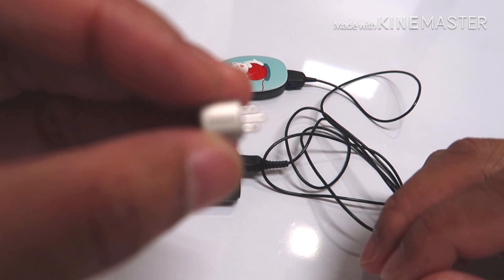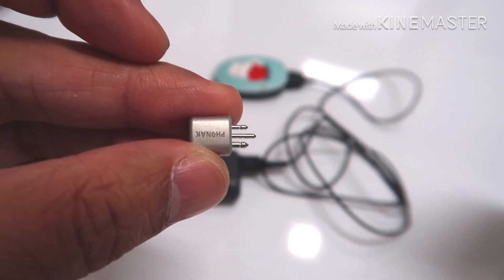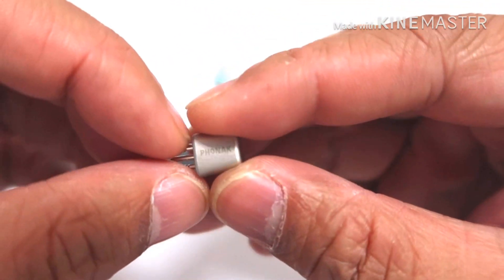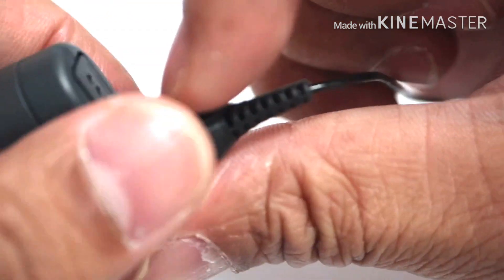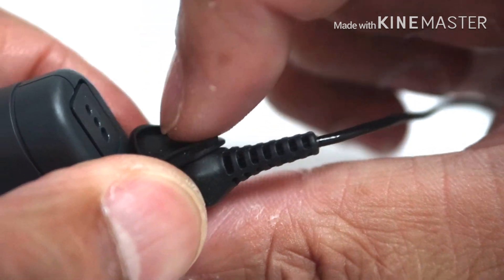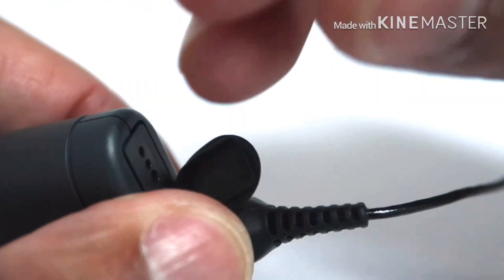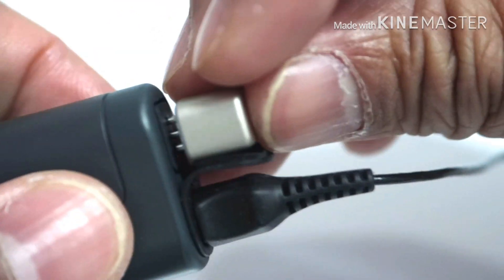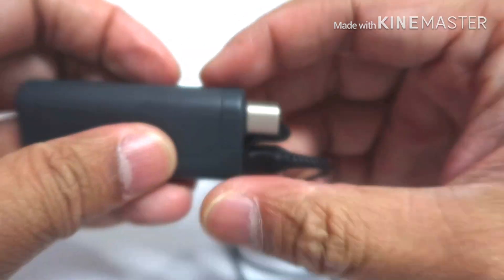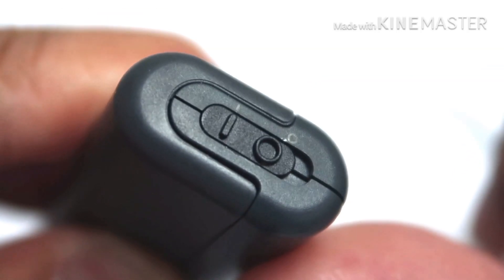The next step would be to connect your FM receiver to your mini battery pack. Take your mini battery pack and remove the FM cover, which is located beside your Rondo 2 cable. Make sure you align the proper pins in your FM socket, and turn on your mini battery pack.